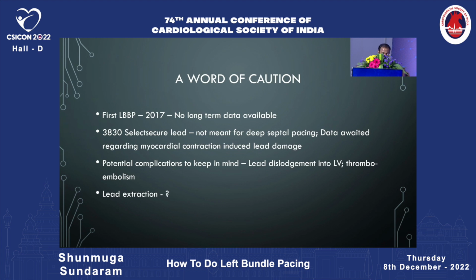And the potential complications you have to keep in mind, like dislodgement into the LV. There was a case report. After 3 months, it got dislodged into the LV. Luckily, there were no reported cases of thromboembolic complications so far. And the lead extraction data, we don't know what is going to happen after 10 or 15 years. We have data at least for 2 or 3 years. In our center, we have extracted a lead after 2 years. Vijayaraman had extracted a lead after 3 years, but we don't know the long-term data. So you have to watch carefully.